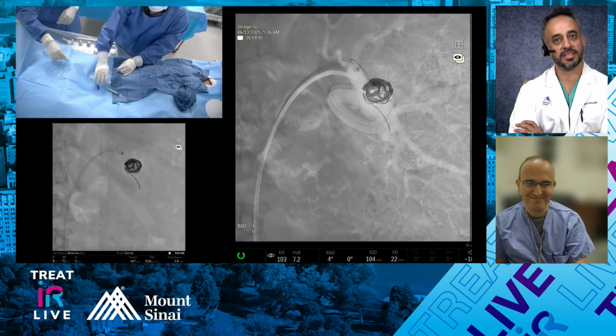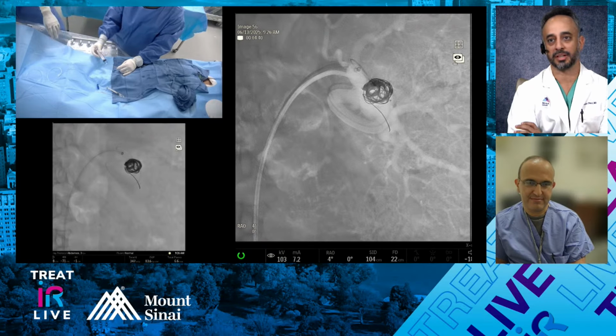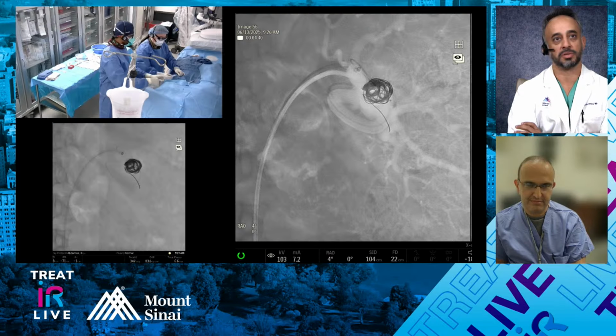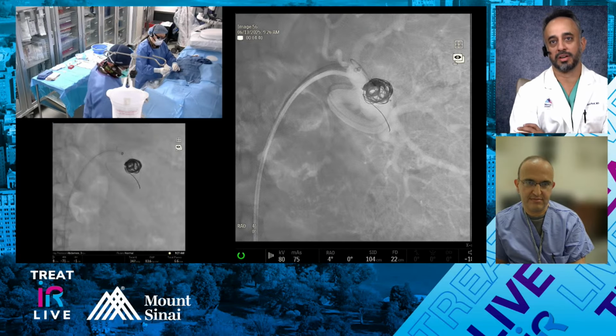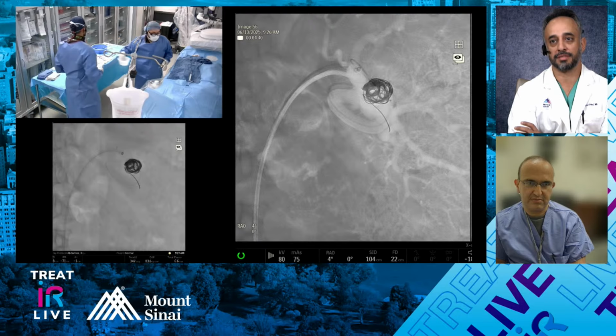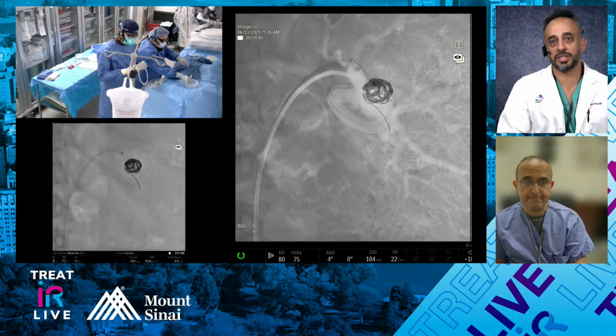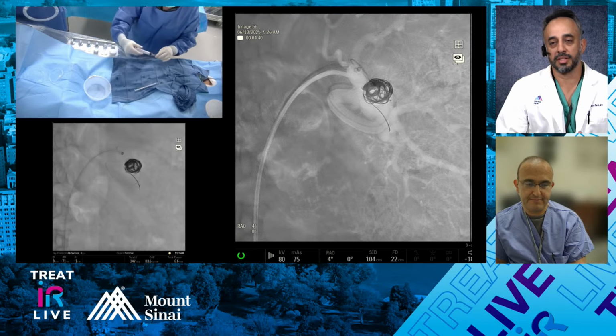I've used liquids for an aneurysm before, more so because we just put so many coils in. Just mix some Onyx, or EVOH 34, and push it to seal up the rest of it. Some of it could just be patience. If you just wait long enough, they'll thrombose. Obviously here it's a little too early, because it'll just all leak out the outflow.